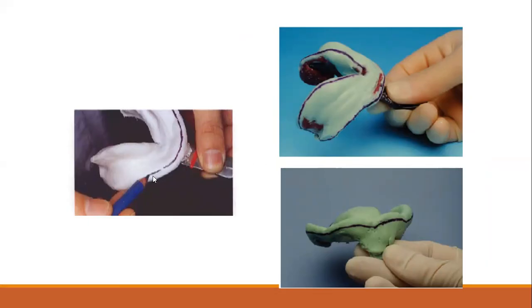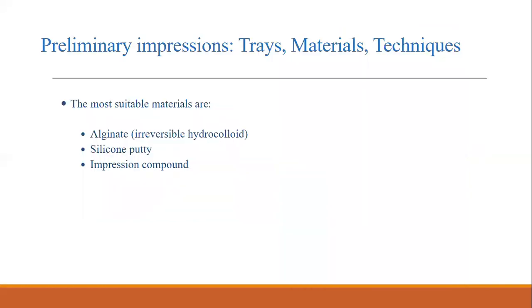Here it's a step نقدر إنه بكوبي بنسل نقدر نحدد السلكس وين موجود عندي، نحط عليه خط على أساس إحنا لما نصب الإمبريشن لحاله ببين عندي على الكاست وين هم البوردرز. نيجي للماتيريال الثانية اللي هي السيليكون باتي.